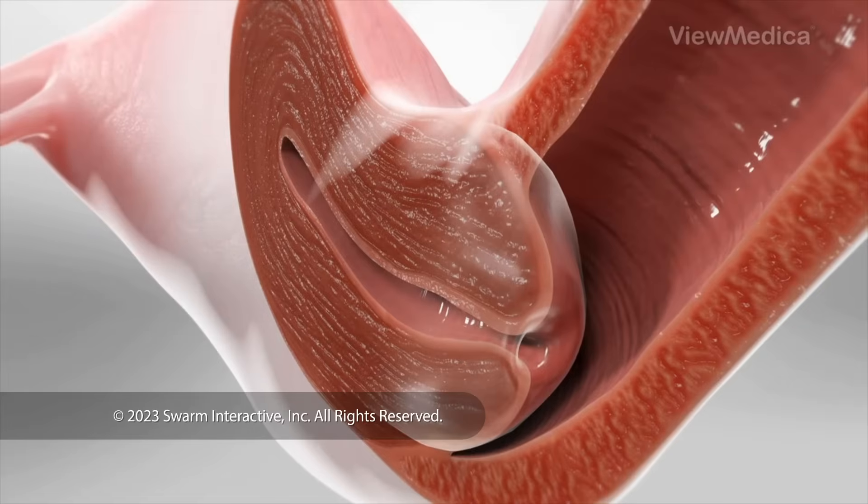It removes cells that, if left untreated, may turn into cancer.